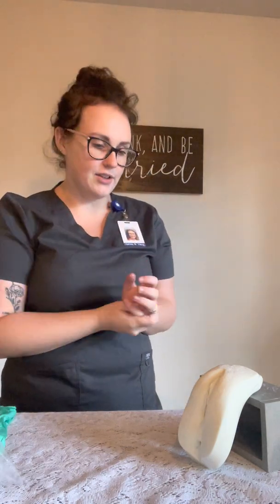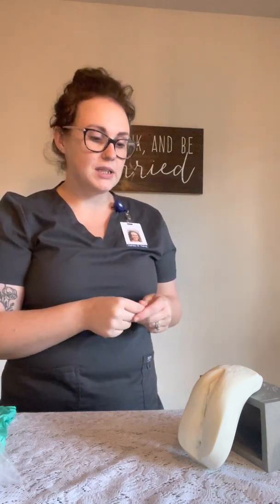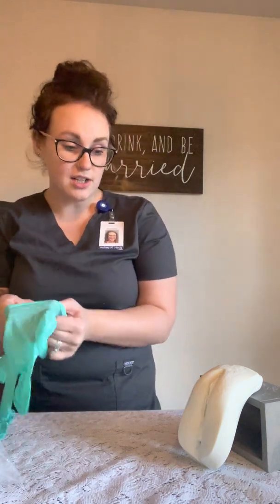So Miss Jones, the doctor has ordered a Foley catheter. This is an indwelling catheter that we're going to go ahead and place. This is going to go into your urethra, and we'll have a drain bag collecting your urine. So before I start, do you have any questions?